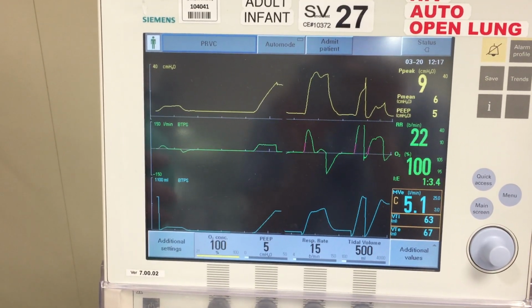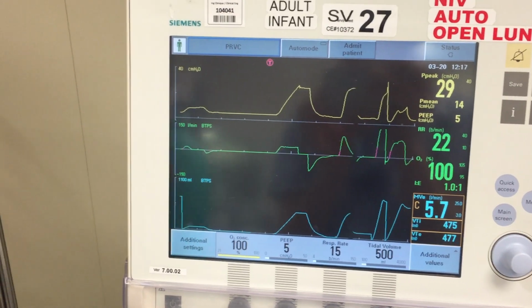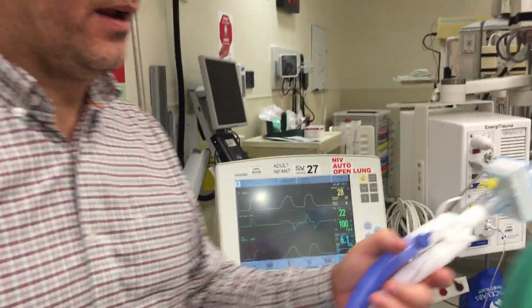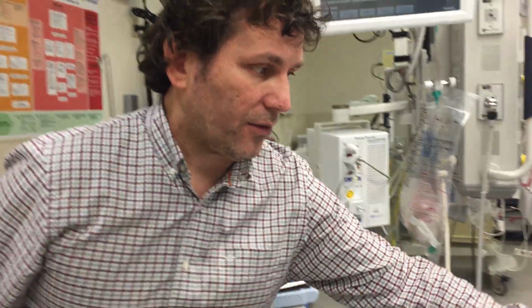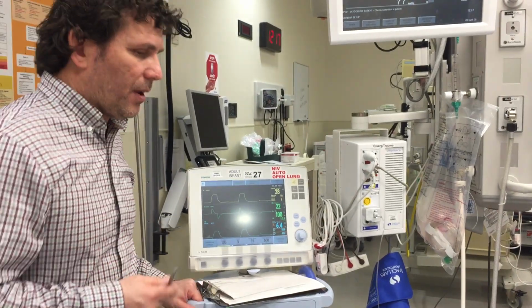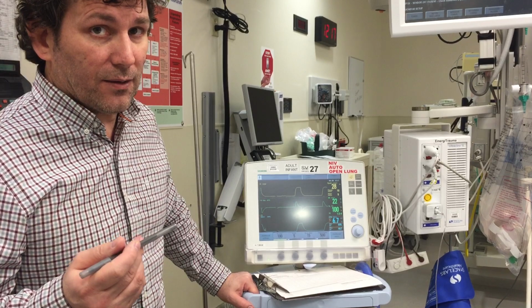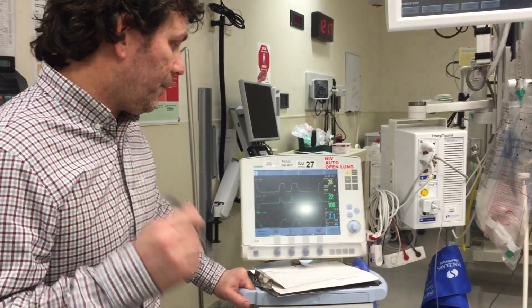At that point, we'll have to look at the ARDS.net protocol, and then we'll have to go with lower tidal volumes as per ARDS.net, which you can get on the web, and I advise you to print it as much as you can if you're in that situation, and follow those guidelines. There's too many to really talk about, but we're just talking about low tidal volumes, high PEEPs, and higher rates with permissive hypercapnia.